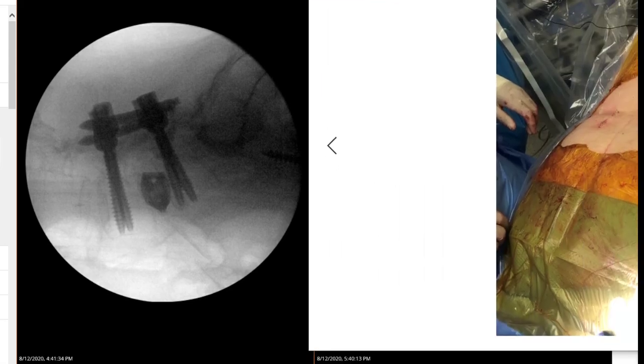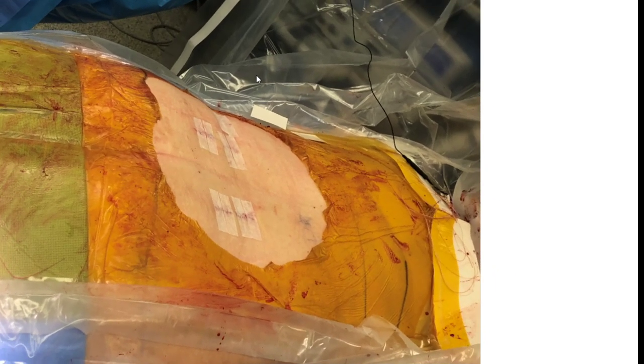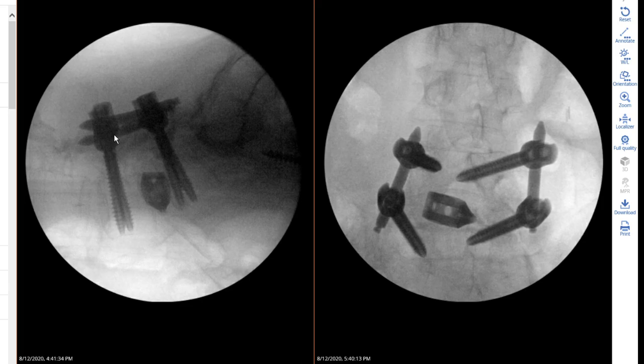This is the picture after we close the skin, and we put some steristrips. Practically, these patients are able to go home the same day, and it is extremely rare that they stay more than 23 hours in the hospital. So this is for all practical purposes a day surgery, even though we did a fusion with a cage and four screws, and the time as well as blood loss really justifies this being a day surgery.